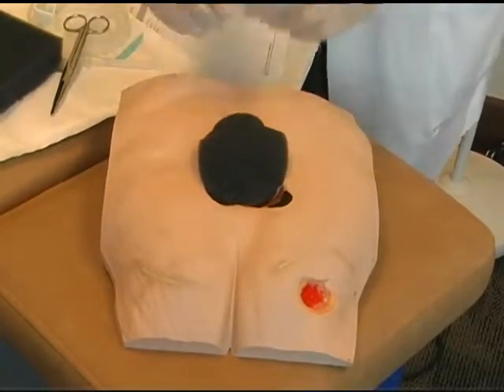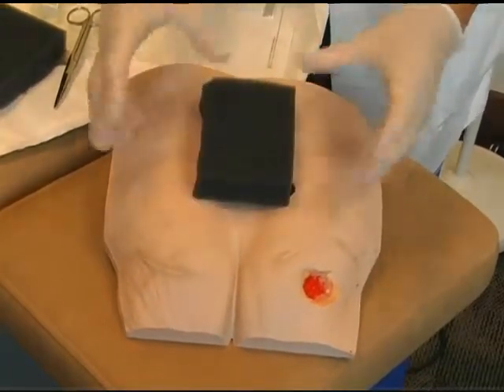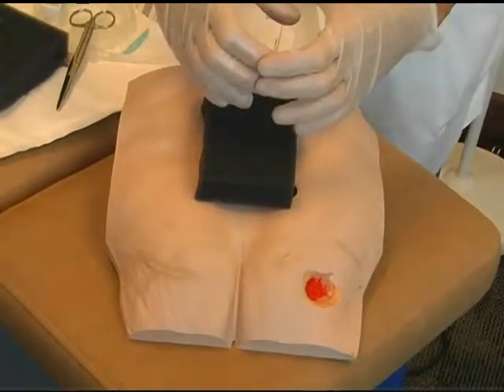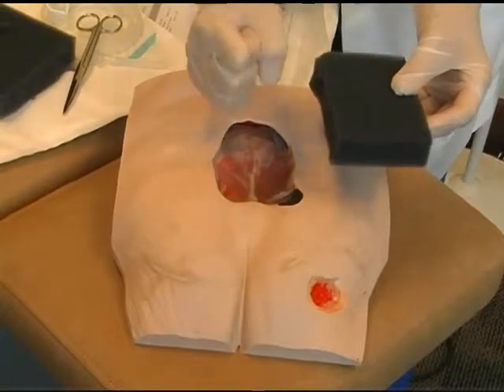You don't want the wound filler to be too small, because once the vacuum is implemented, the foam actually ends up being smaller than the surface area of the wound.